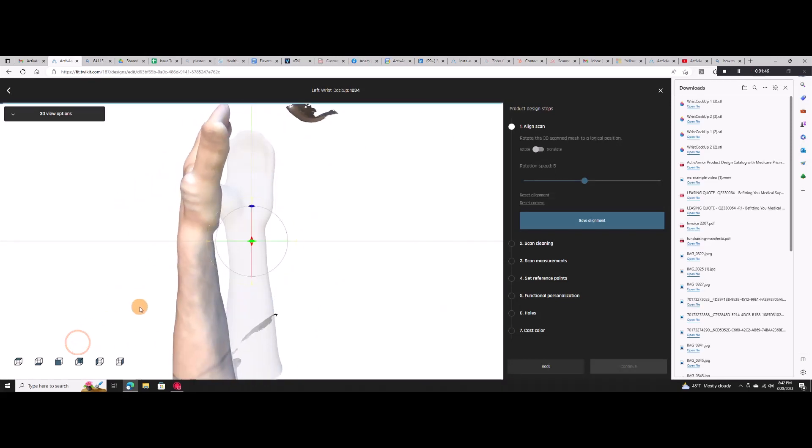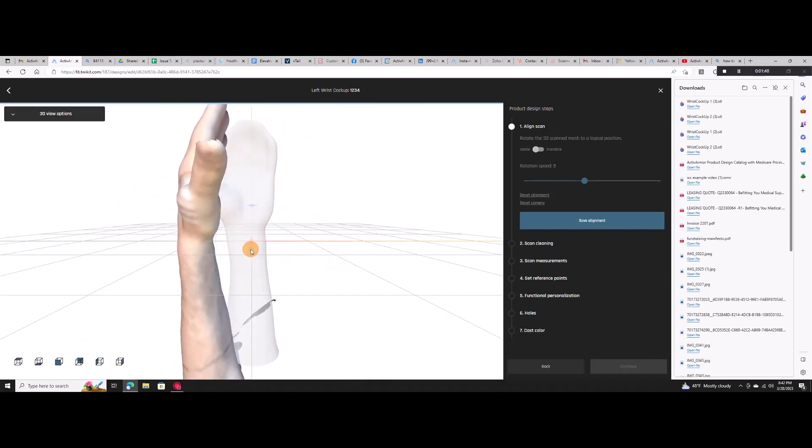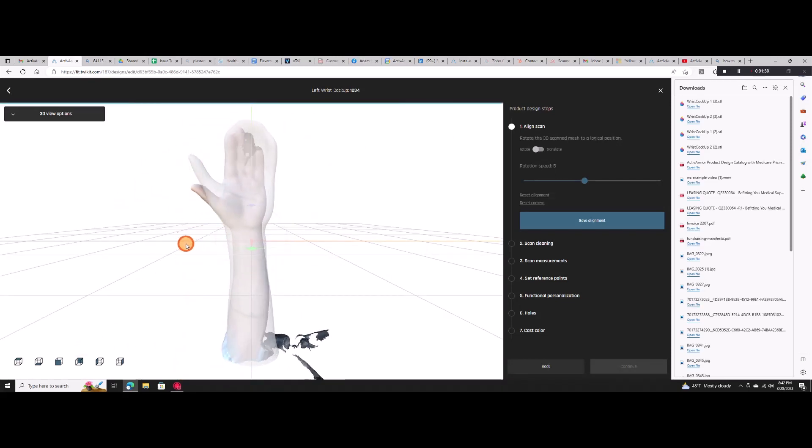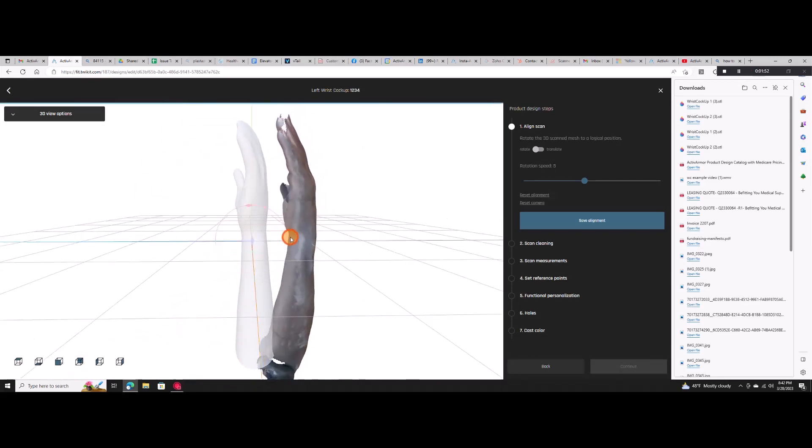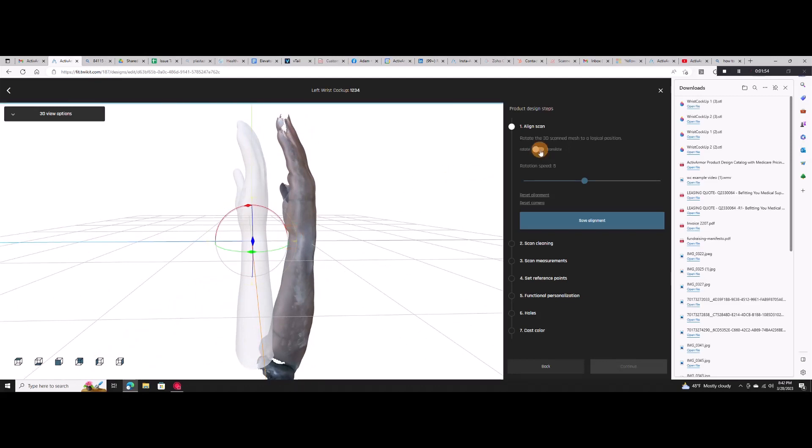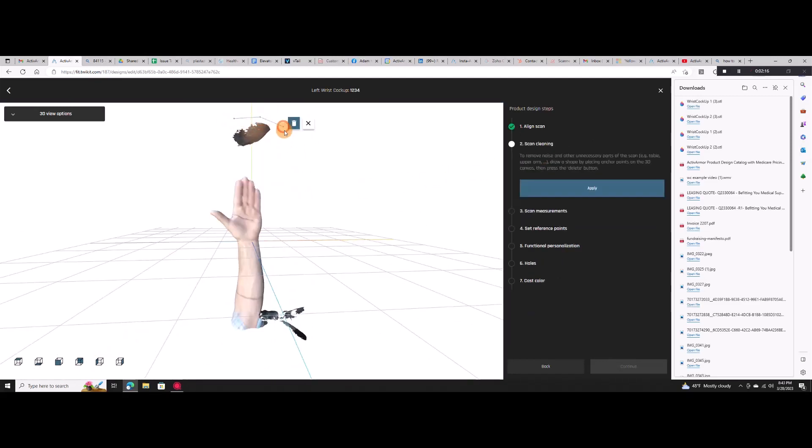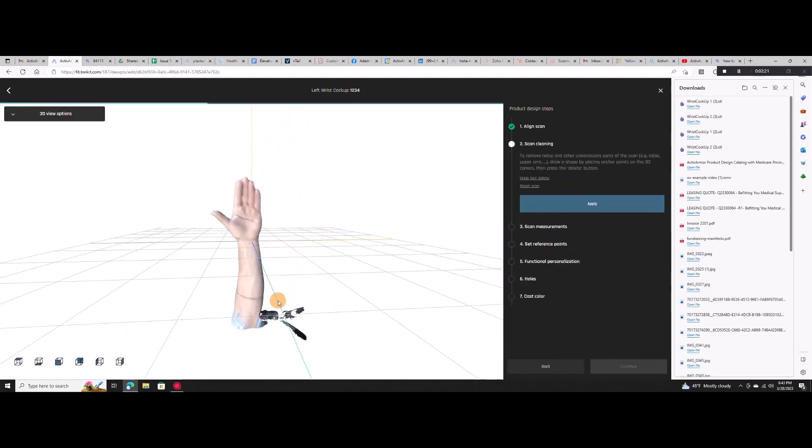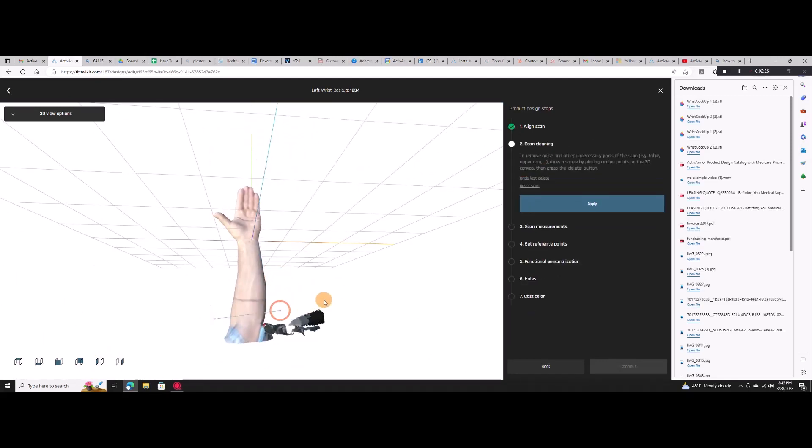Orient the scan with the guide limb. It's easy to rotate and translate the image. You can then remove any extra scan material or noise.